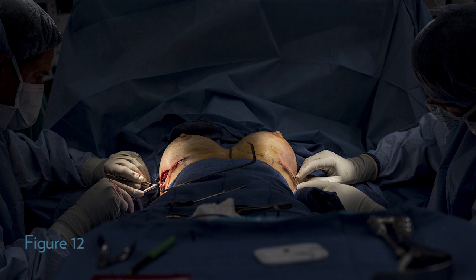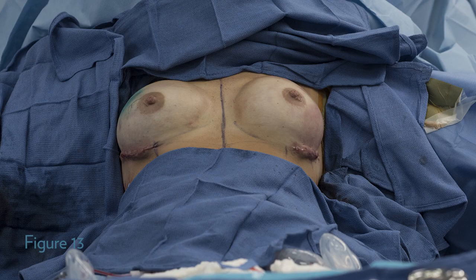The incisions are then closed in layers. The final result with the incisions closed.